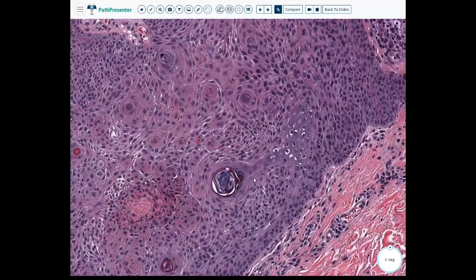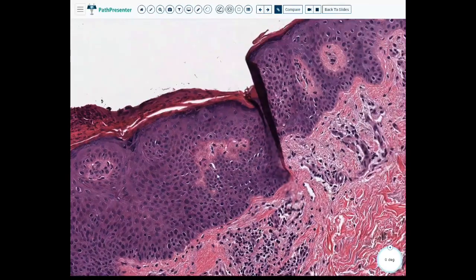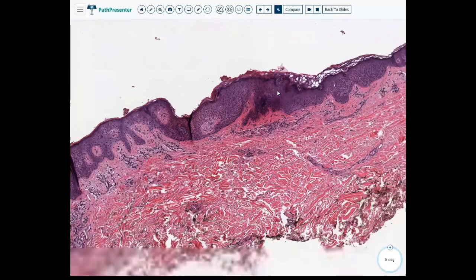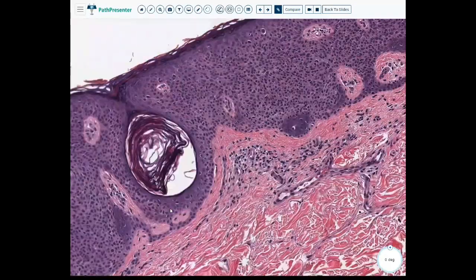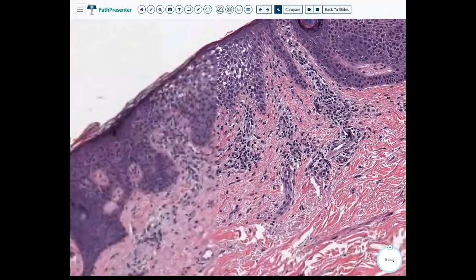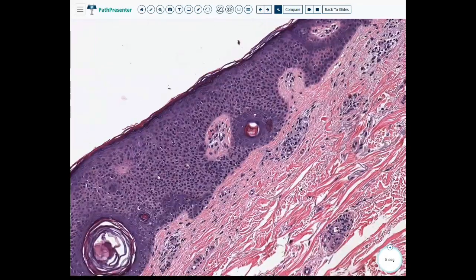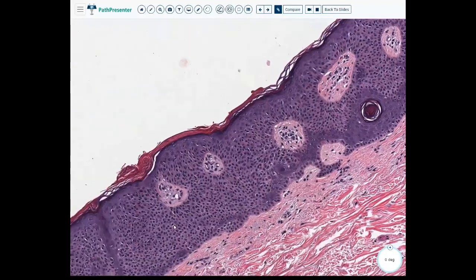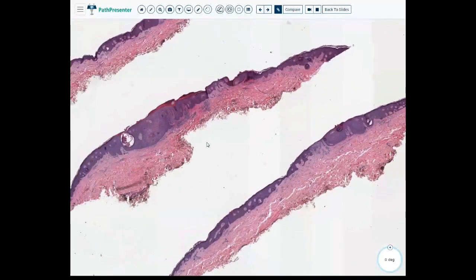Going through the epidermis, we're asking: is there any atypia? Again, more pseudohorn cysts. This is a relatively straightforward case of seborrheic keratosis. The fact that the epidermis is really basophilic can make this somewhat challenging; however, there really isn't significant atypia. There is some glycogenation — those are the little halo-type areas — and there is some spongiosis, but remember that can also be artifact. This is an SK, a seborrheic keratosis. Remember: coin-like, stuck-on appearance.